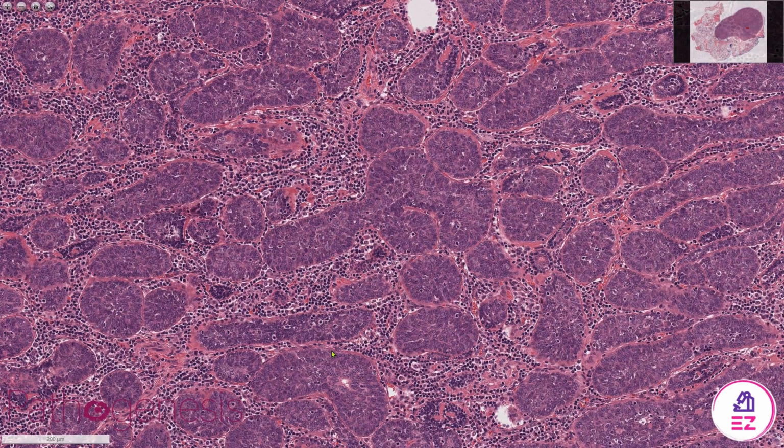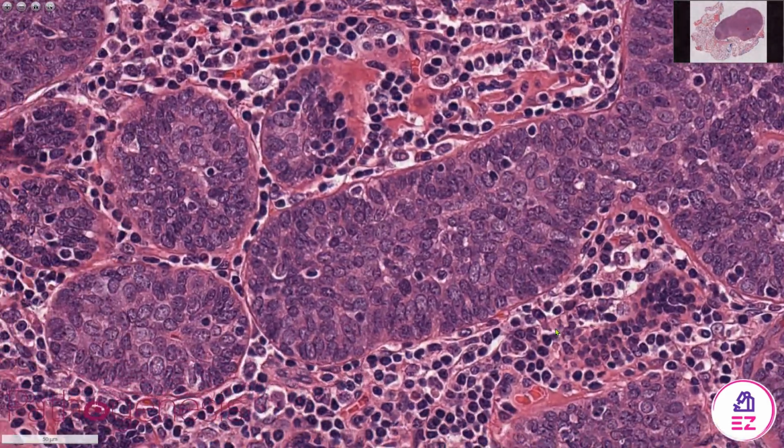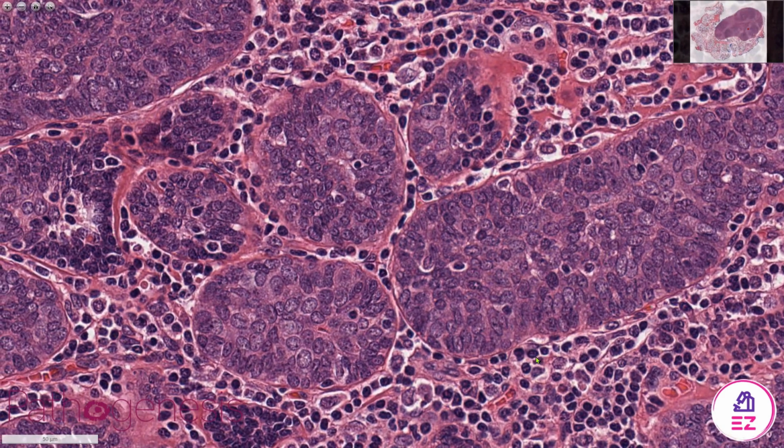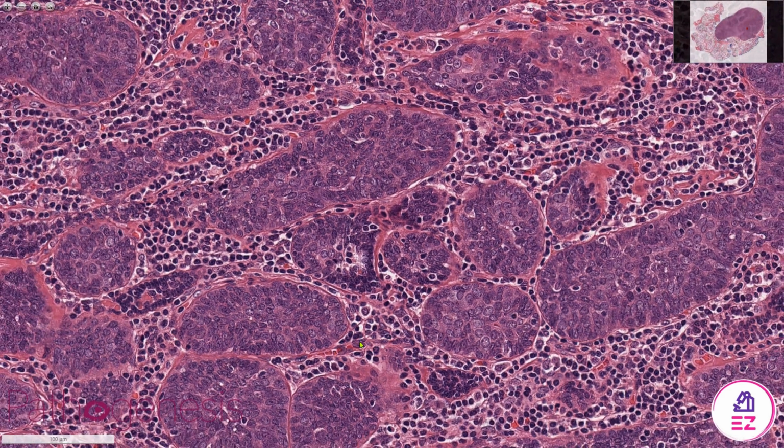This tumour also had quite a raised Ki67, indicating a high turnover. I think it was around 20%. Pleomorphism-wise, I mean, there were occasional cells which were hyperchromatic. There's a slight variation in cell size and shape, but it wasn't a dominant feature.